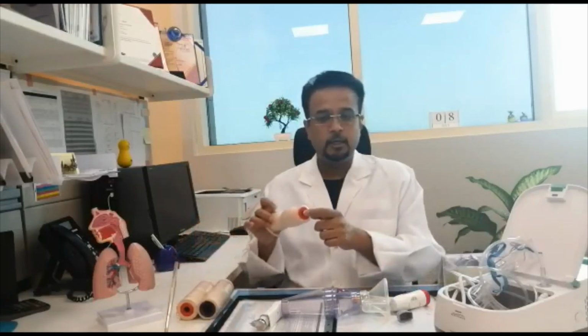So this is how you use the inhalers, and your doctor will be able to tell you how many puffs of the preventive or the cortisone inhalers, how long you need to use them, and how many puffs you need to use in the day, morning once or twice depending on the child, and how many puffs you need to use of the relieving medicine, which is the Ventolin, when the child is having asthma. They will be able to make a judgment based on the child, and they will give the asthma action plan.